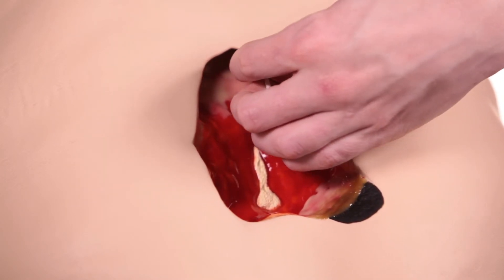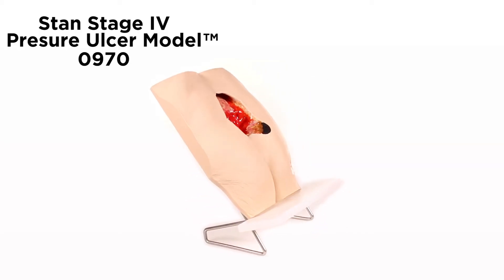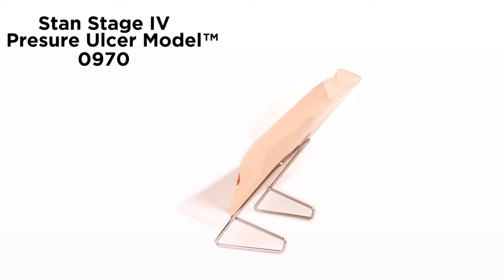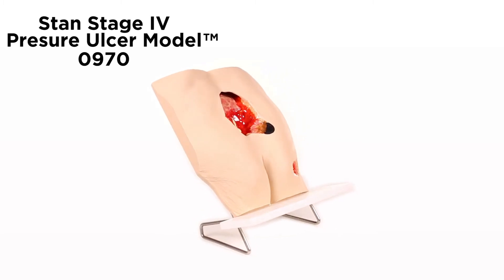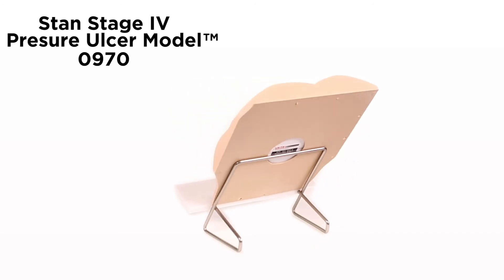Wound assessment has become critical to the operation of health agencies, as inaccurate wound assessment can affect reimbursement, cause inaccurate reporting of patient outcomes, and the appearance of potential adverse events. This model makes it possible to visualize and understand the differences in wounds, and once the different etiologies are understood, you can discuss and devise treatment plans that will deliver optimized patient care.